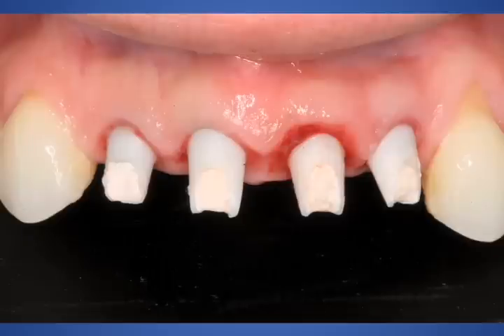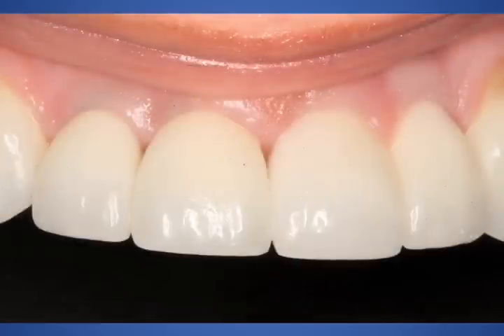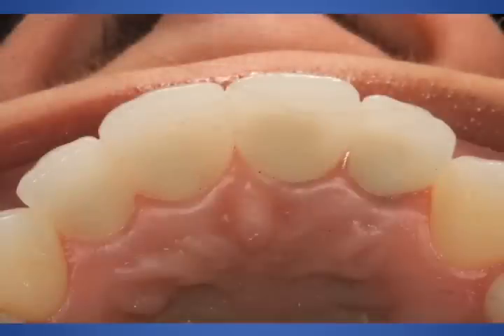Now, tooth number 9 is a little bit raw, a little bit inflamed from the transitional or maybe some excess cement in that area. But as we'll see, the tissue will heal up nicely once we get everything in position. The final zirconia implant crowns are cemented. We have fairly good emergence profile, fairly good interdental papilla. Again, this was a few days after cementation, so the tissue still has some responding to do.